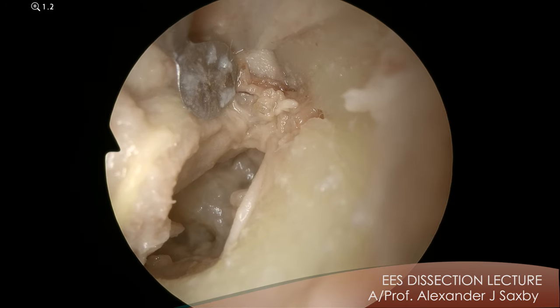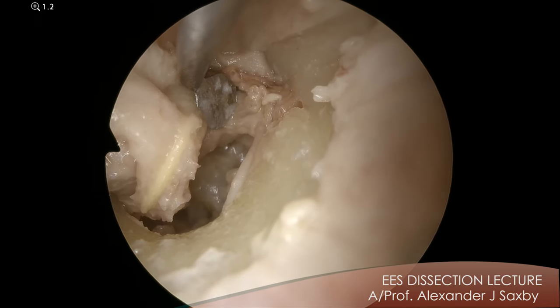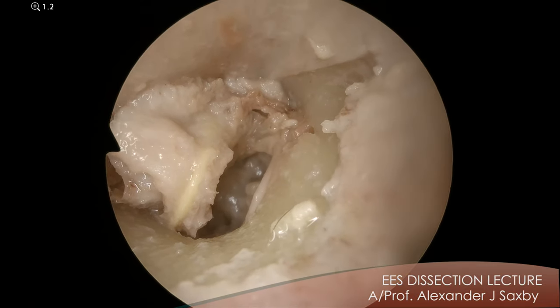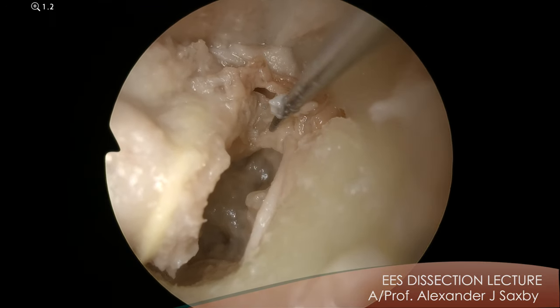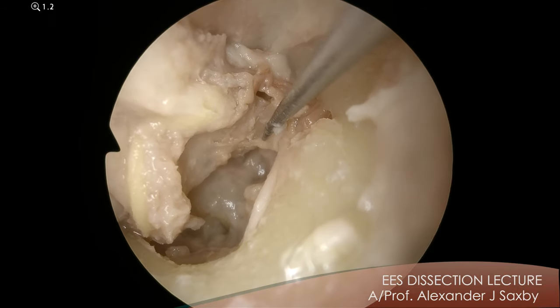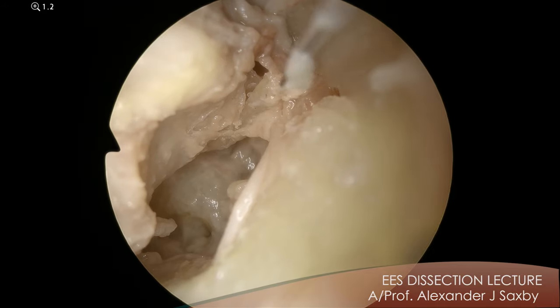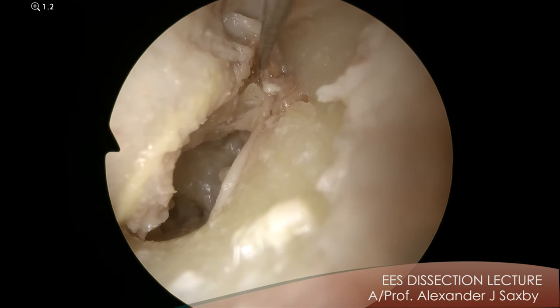So just pulling it down and now we can see the lateral process of the malleus. So can everyone see this thing here is the lateral process. There's often a little cartilage cap which if you pull it off helps you find the plane. The cap is just there — that little indentation. That's the cartilage cap that's come off and that usually gives you the correct plane. So now you can bring in your endoscope and look for the plane on the malleus. Now you follow the malleus handle and make a plane onto the bone.